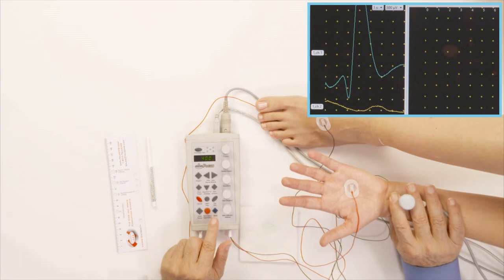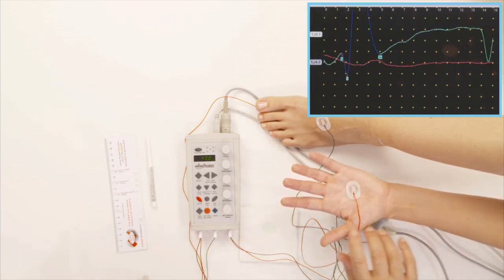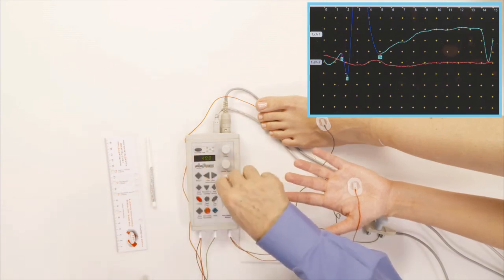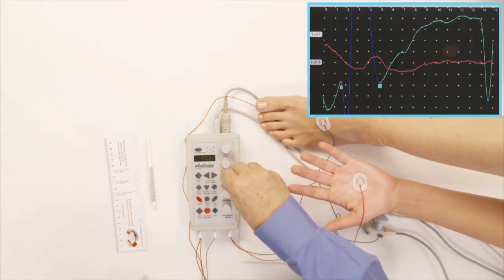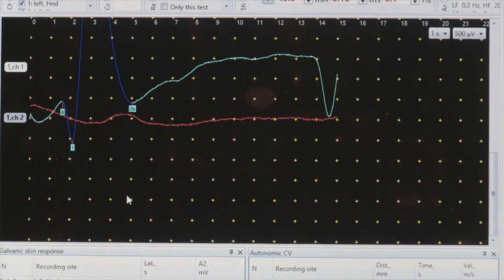And we got the response. And the response is stored. And as you see, it's a huge response. So I'm going to decrease the sensitivity a little bit to see it better. I'll bring it down here.